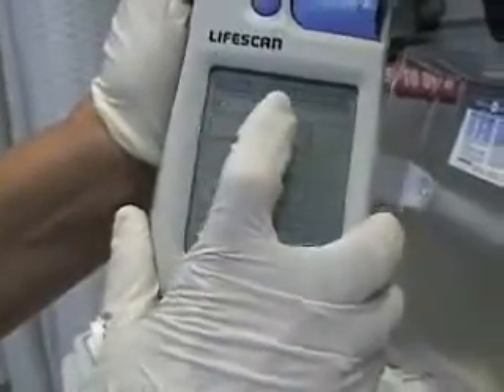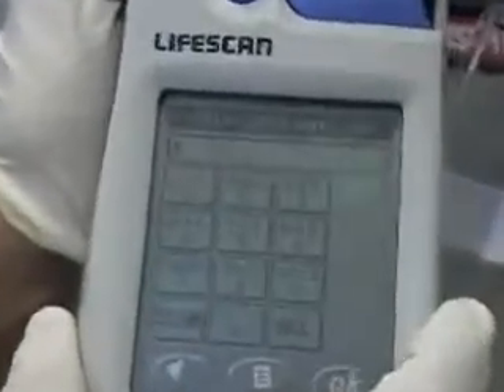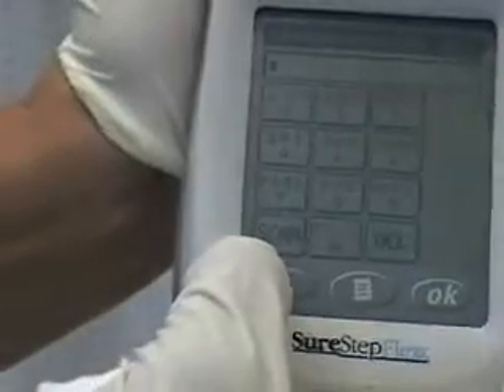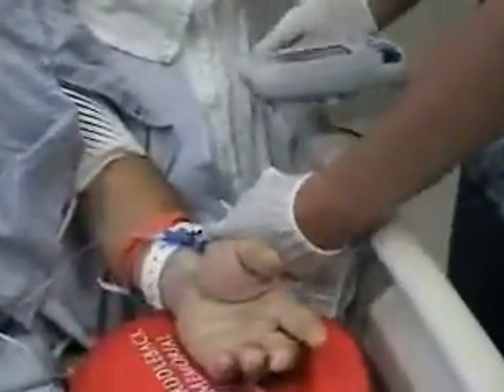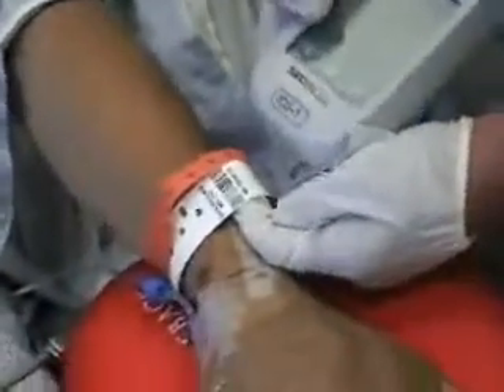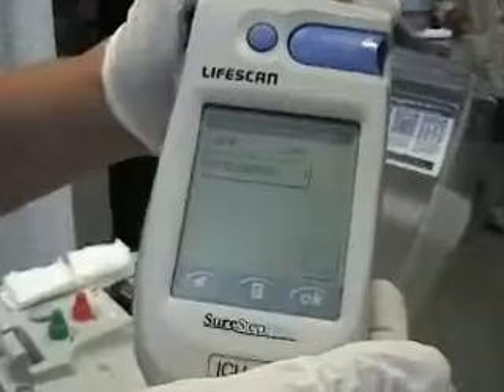Now it says enter patient ID number. So you take this — in the bottom left-hand corner, you see scan. What I'm going to do is, just like at the supermarket where they have the scanners, line the bottom part up right here where it says MR — medical record number. We're going to hit scan on the bottom, go back and forth. You saw that red line? Then we're going to hit okay.